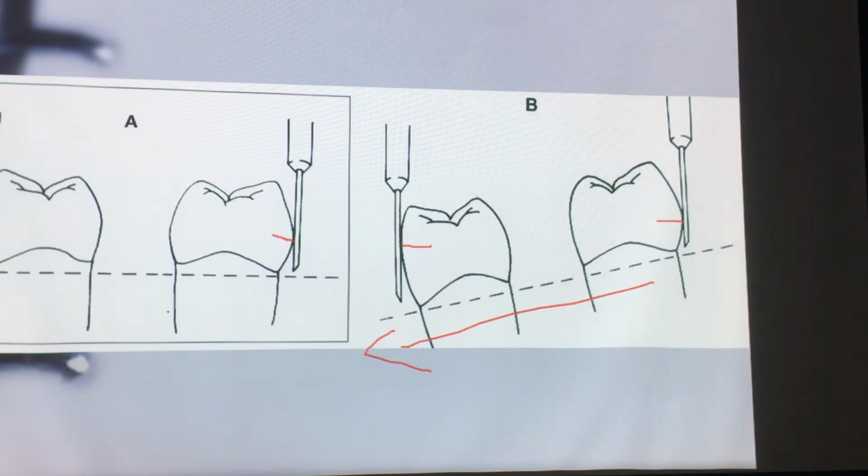We utilize the surveyor to identify these undercut areas, either utilizing the ones we want or discrediting other clasps that we cannot use, and some that are more favorable, and some that may be more favorable for aesthetics, and some least favorable for aesthetics. Some more favorable for retention, and some least favorable for retention. So, like I said, there's no perfect right or wrong, but there's just getting closer to optimum. So if we could balance the undercuts on left and right for our first cases, this would be our goal. And once we get accustomed to using our surveyor, then we can get a little bit more elaborate in changing guide planes and changing path of insertions to optimize this.